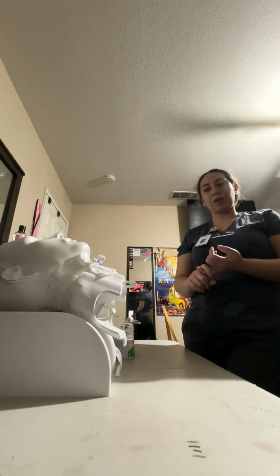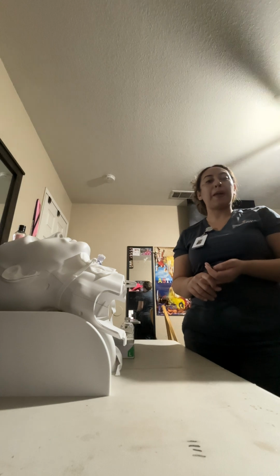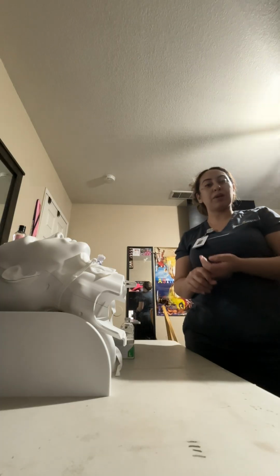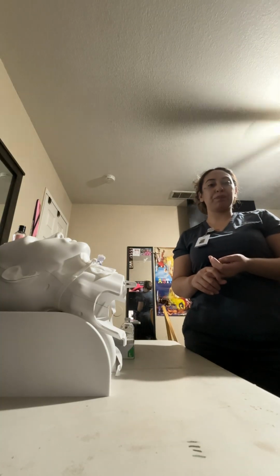After I've introduced myself, provided privacy, and hand washed at this point, I'm going to educate the patient and just let him know what the doctor has ordered. I'm going to get the patient's consent. I will grab my supplies and I will perform.